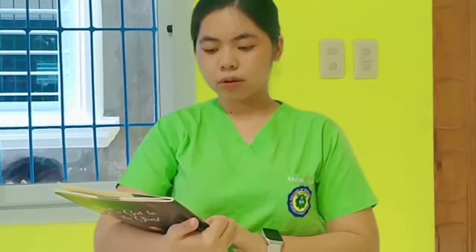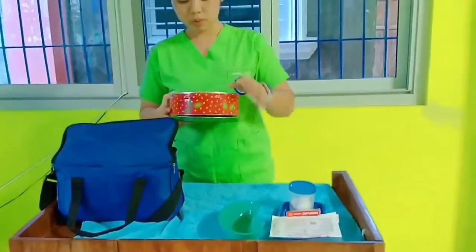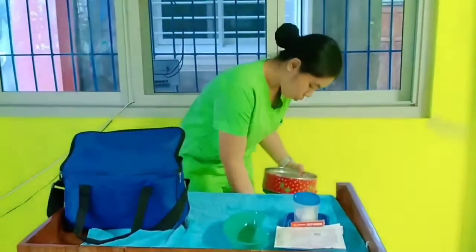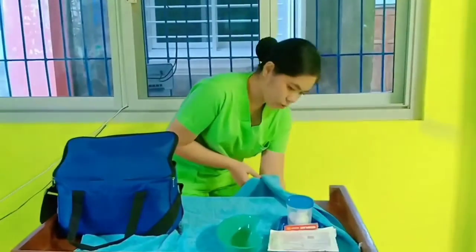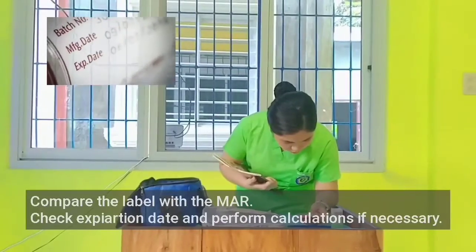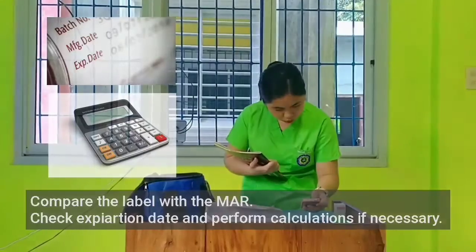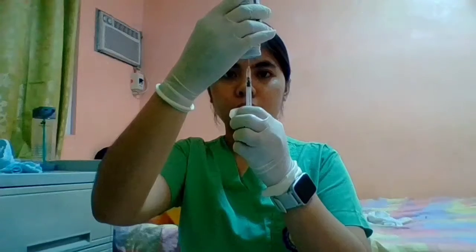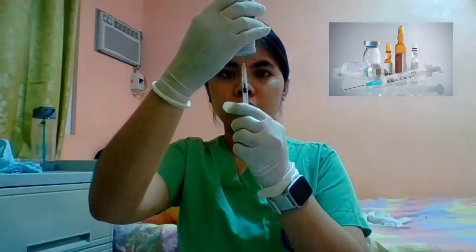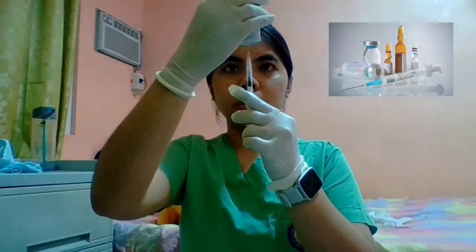Read the medication administration record and select the proper medication from the patient's medication drawer or unit stack. Compare the label with the MAR. Check the expiration dates and perform calculations if necessary. If necessary, withdraw medication from an ampule or vial as described in the previous skills.